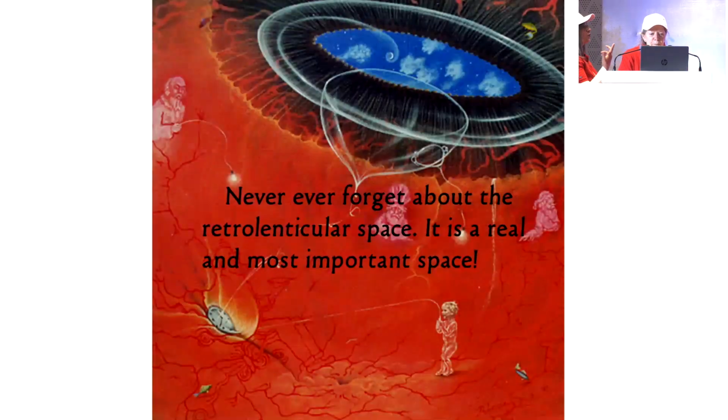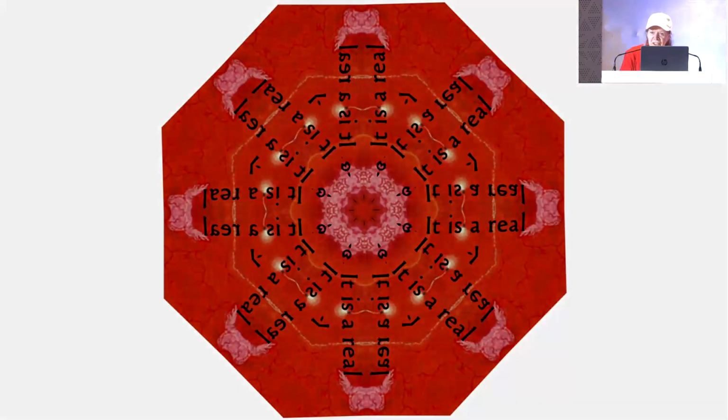Never ever forget about the retrolenticular space. It is the real space and most important to support the capsule and to support accommodation.